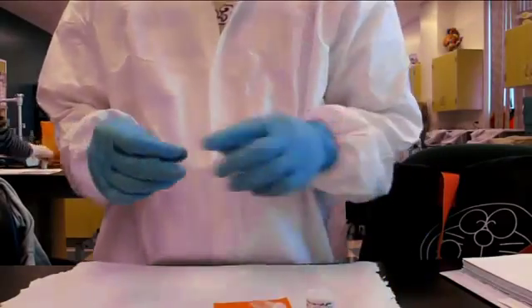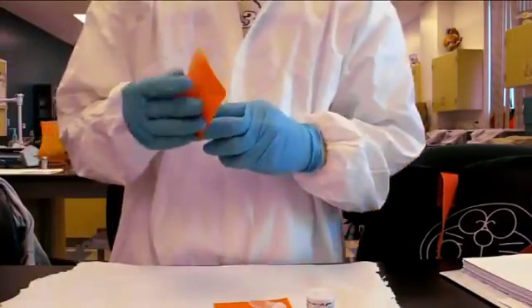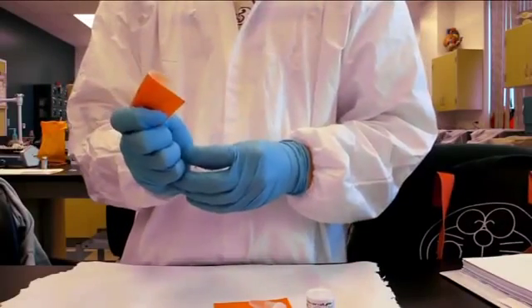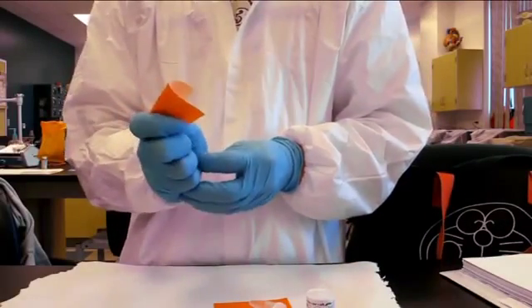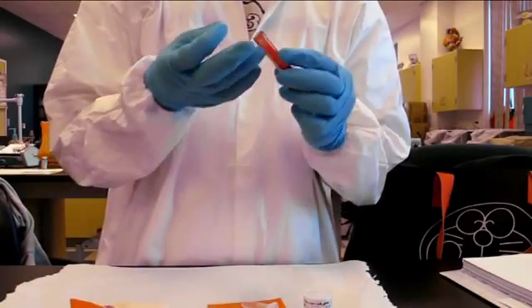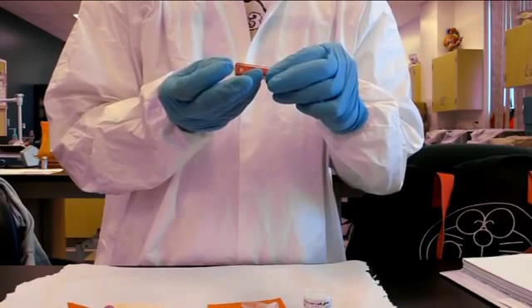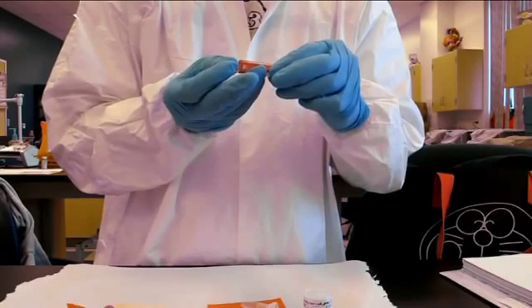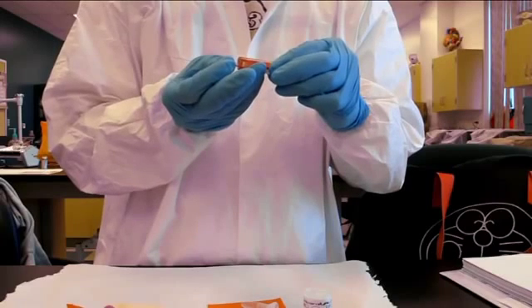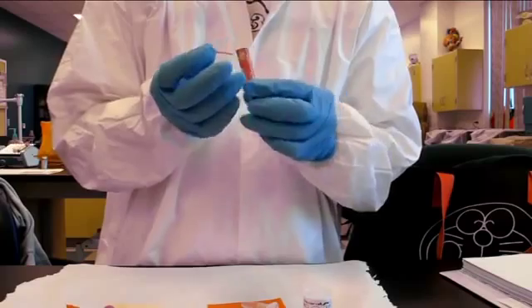Obtain a 5 microliter capillary tube from the set provided. Carefully open the whole blood with an absorbent pad and insert the capillary tube. Any excess whole blood should be wiped off.